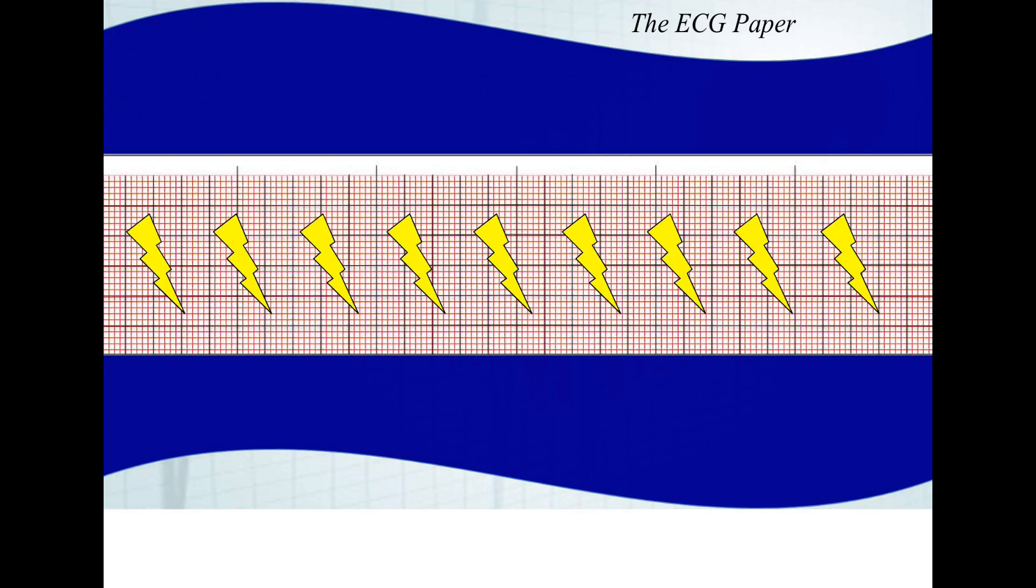Based on what we've learned about EKG paper, we can make determinations about regularity and determine heart rate. For instance, we said this was a six-second strip, because there are five large boxes for every second, and we have one, two, three, four, five, six seconds.